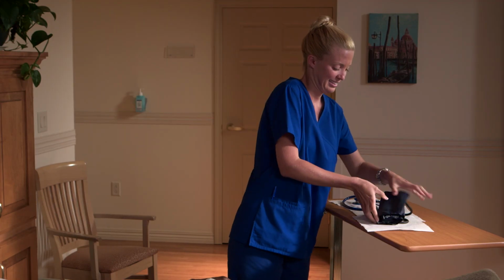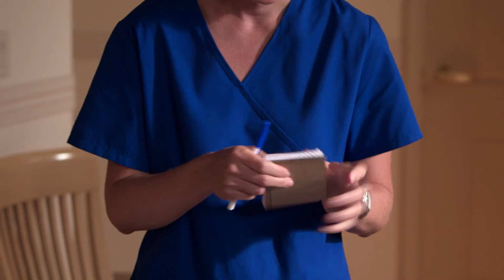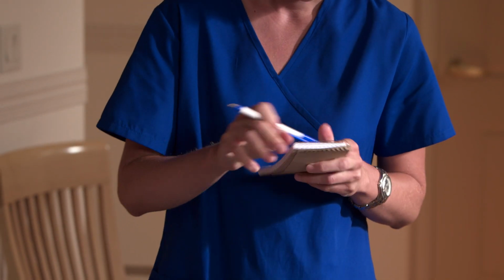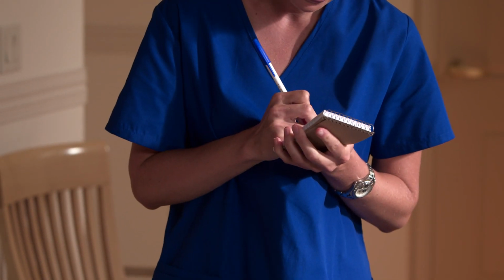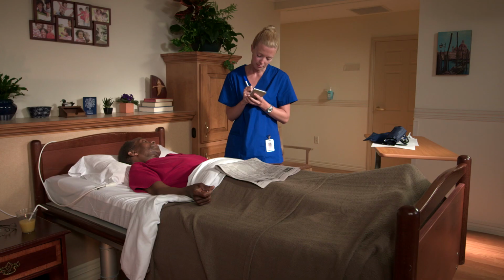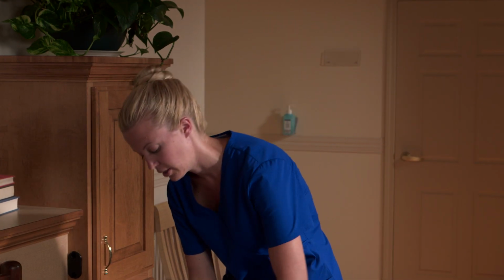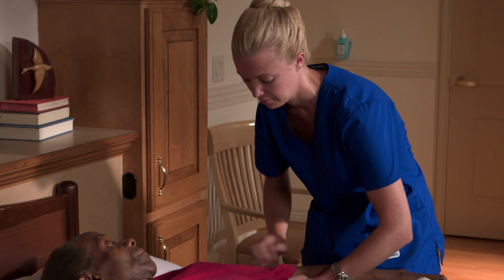Remove the cuff from the person's arm. Okay, now I better write this down before I forget it. Write down the person's name, the time, and the blood pressure measurement. Follow your completion steps and ensure the person's comfort and good body alignment.